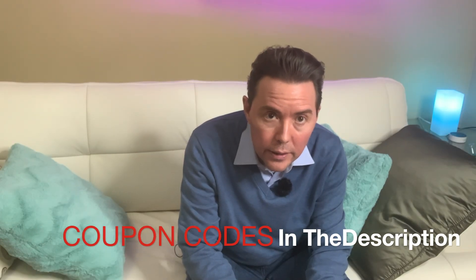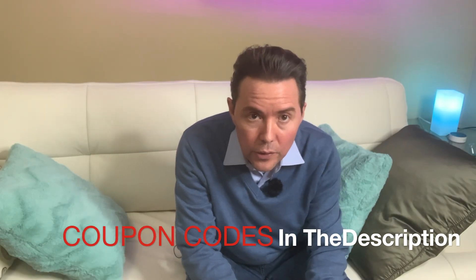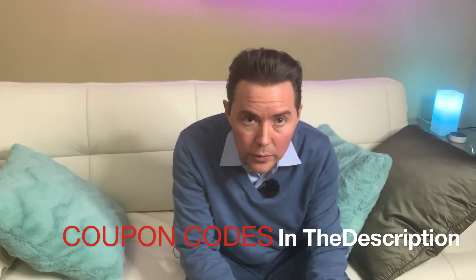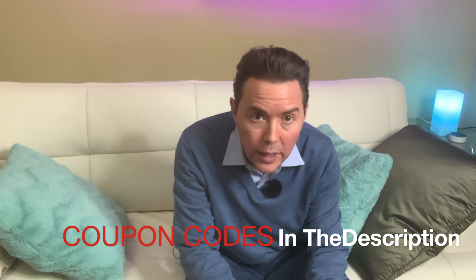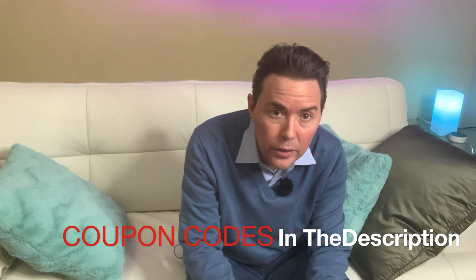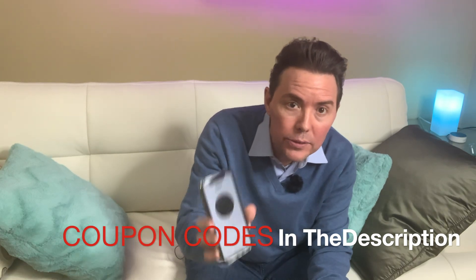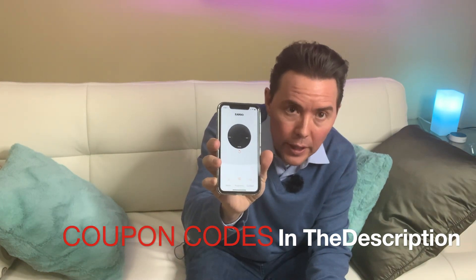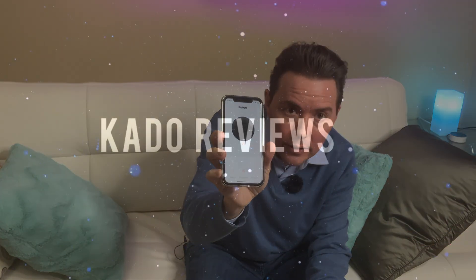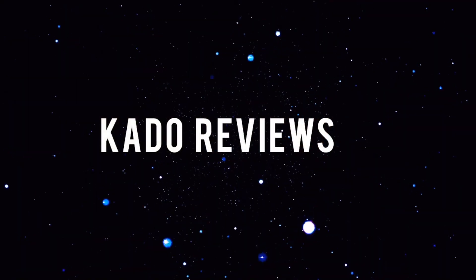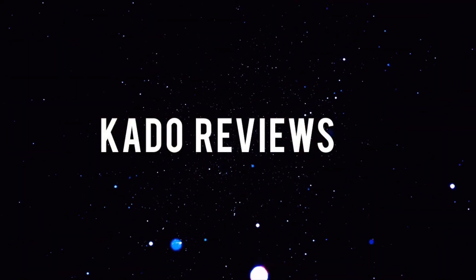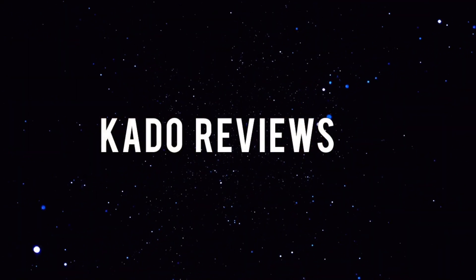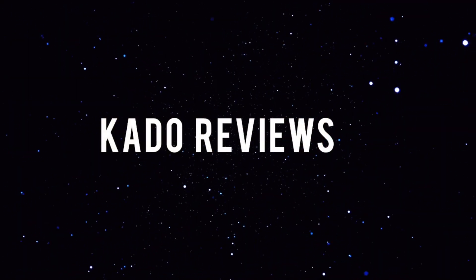So you're looking at buying the Ergo Neo or Ergo Neo Hi-Fi and you want to know what the app is like. We're going to find out today. So this is the second iteration of the app for the Ergo Neo and now the Ergo Neo Hi-Fi, and the first one was abysmal. It was very limited, there were only a few things that you could do with it.